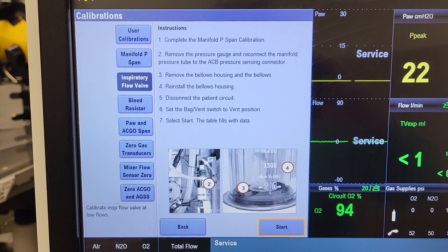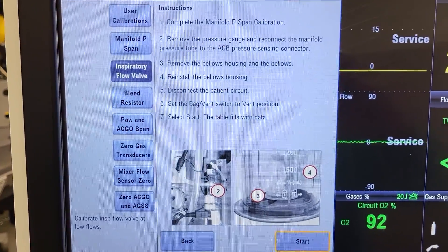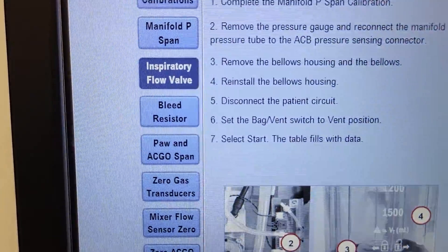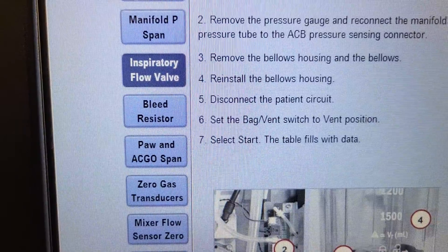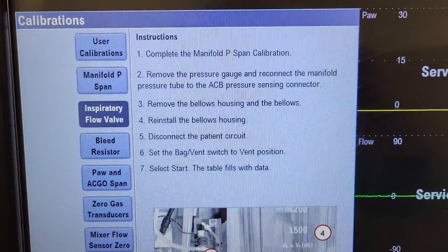Here we are on the GE Care Station 650 again, and what we're doing is the inspiratory flow valve calibration. There are some steps listed right there in the software.